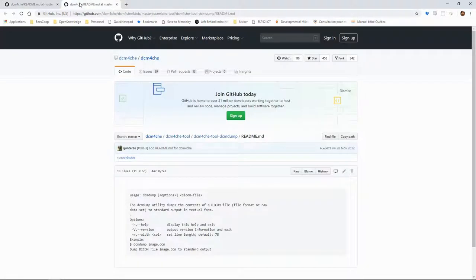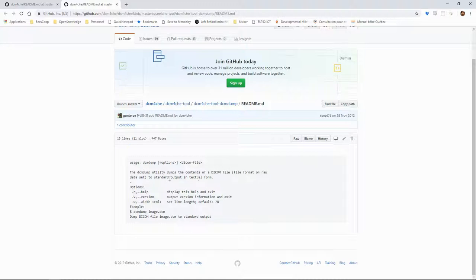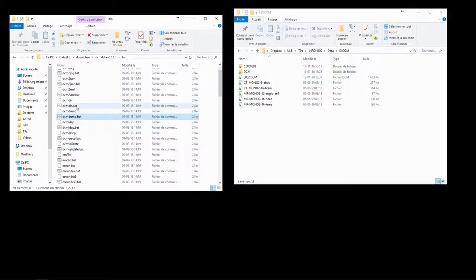One of those tools is DCMDump, which we can use to display in the command line the content of a DICOM file. The content will be dumped in text format, but formatted in a way that makes it easier to read.